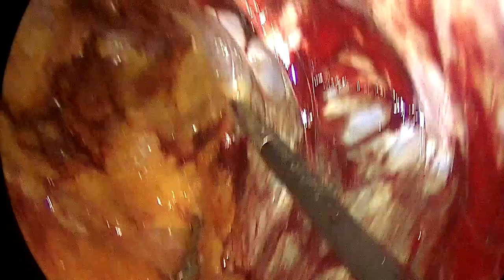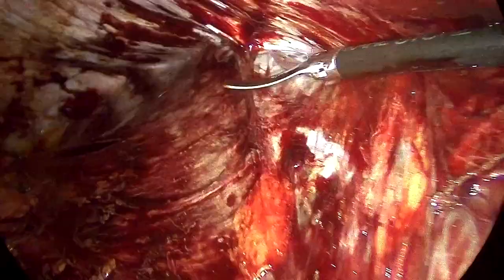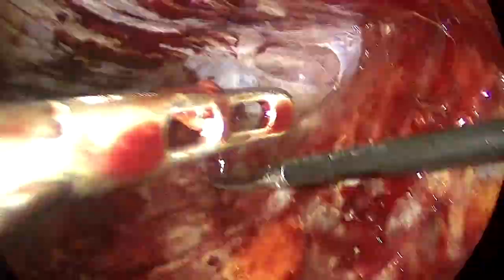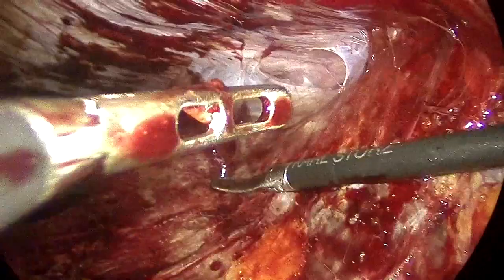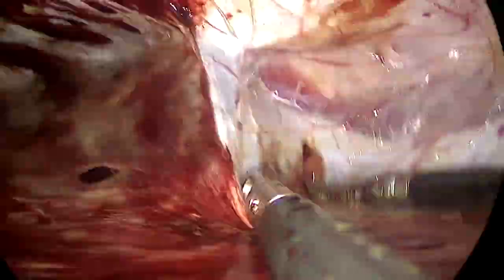What I do is divide them sharply — no need to use cautery or any sort of energy. By dividing them, I get access to the plane where I want to perform the separation of these two layers. Now, if I go lateral early enough, I am going to reach the plane that you would reach when doing a bottoms-up TAR.